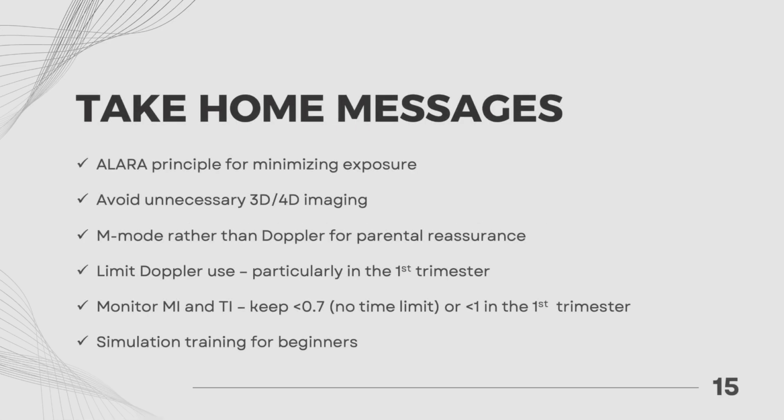To summarize, these are the key measures we should take to ensure safety of patients undergoing ultrasound assessment. Firstly, we should apply the ALARA principle, not only for pregnant women, but also children, teenagers, and young adults. The aim here in this population is to minimize the exposure to the ovaries as much as possible. Secondly, 3D and 4D imaging should not be performed without a valid medical indication. This means refusing to take images simply for keepsake purposes.